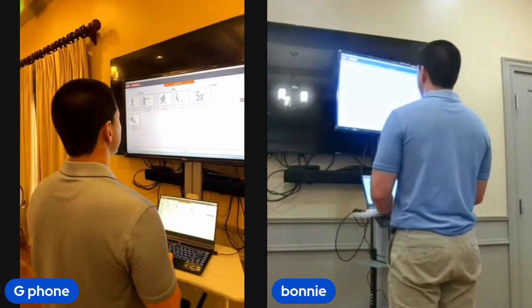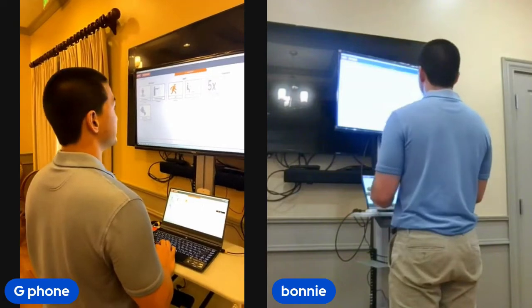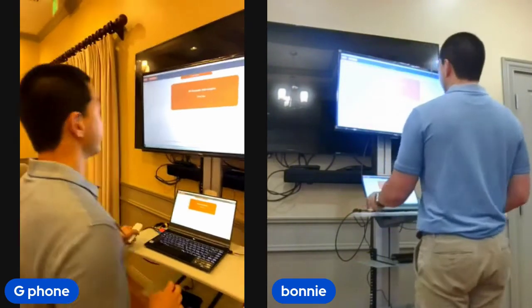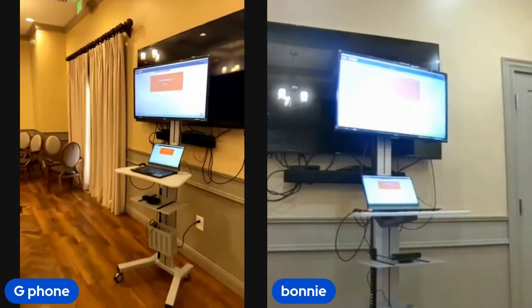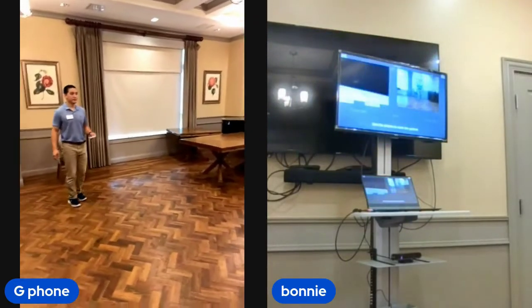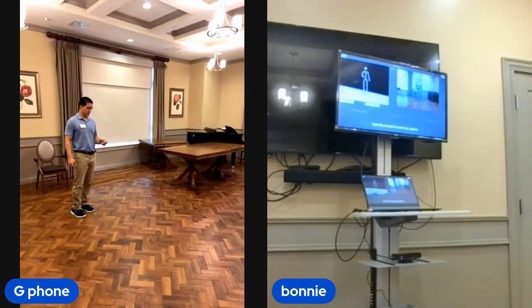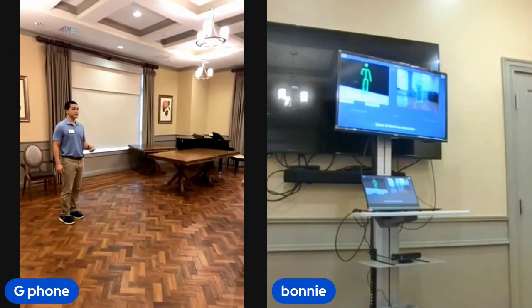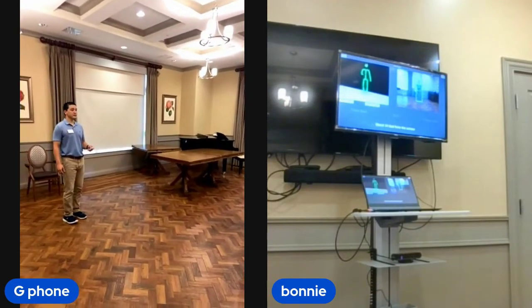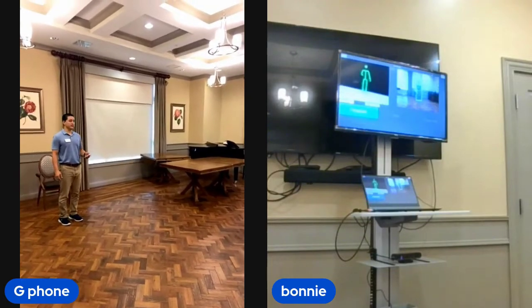I think I'll just do the gait test. And this is looking at your walking speed, your step length. There we go. Let's see if I have it right back here. So you need them to stand 14 feet away. At the toe, walk briskly towards the sensor. It's a little bit of a process. I need to highlight the resident. Nice, I got it. All right.